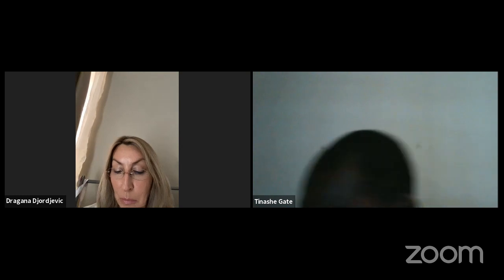Sorry, to add on what Tinashe is saying, at times when we are talking about quality, Karl Storz provides quality equipment. When we compare a Karl Storz 1 chip camera, which is a quality 1 chip camera, if it was face to face, I would have shown you using the camera so that you see the difference of the pictures. For somebody who is not technical, like some of you, you won't notice much of the difference. But when you are working in surgery with a good monitor and those cameras, comparing 1 chip and 3 chip, a person who is very technical can tell the difference: here I'm not seeing the sharpness of the picture, the clarity, even the colors. You can differentiate blood and tissues, you can actually see the veins with the 3 chip.